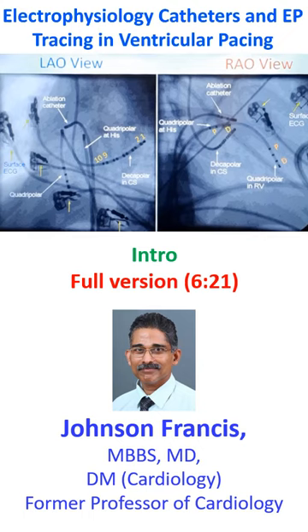Just before discussing an electrophysiology tracing in ventricular pacing, we will have a look at how the electrodes are placed. This is the left anterior oblique view and right anterior oblique view on fluoroscopy. Multiple catheters can be seen here.